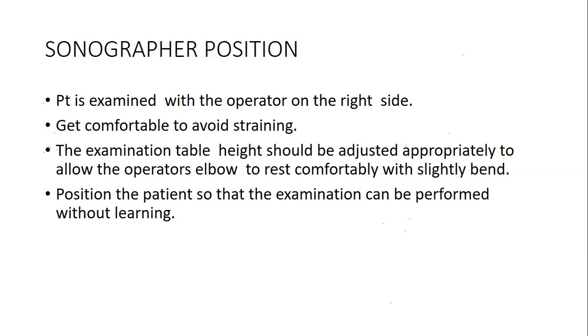Get comfortable, adjust your bed so that you don't strain your shoulder. The more you do echo, in my experience, you find that sometimes you find very bulky patients and you have to strain. So you start having some kind of strenuous pain around your waist because you are trying to pick images. Sometimes females with big breasts, it's also a challenge. You have to go down the breast until you pick the heart. So it can be a little bit straining when you're examining that.